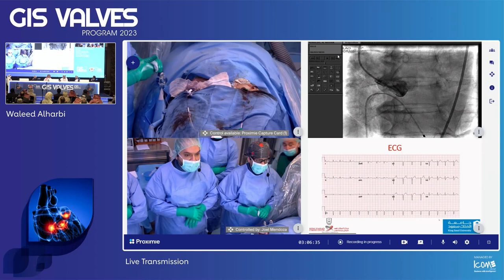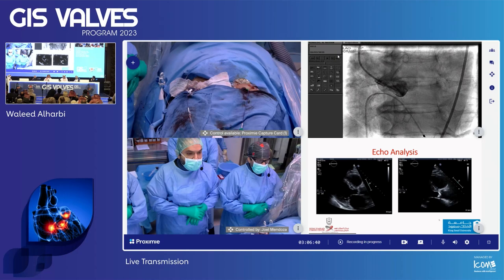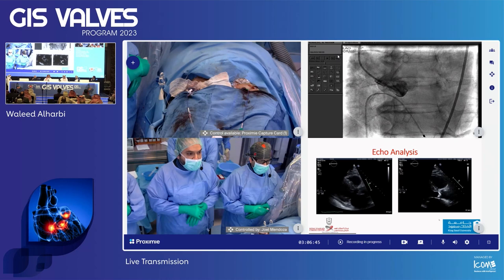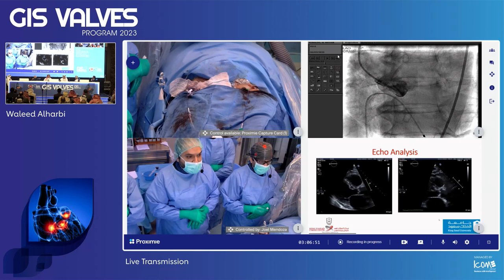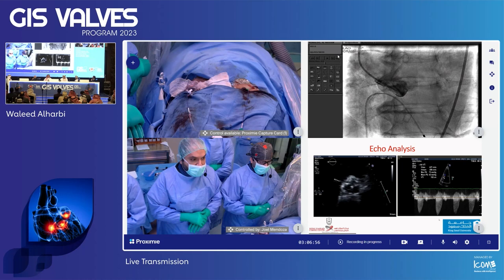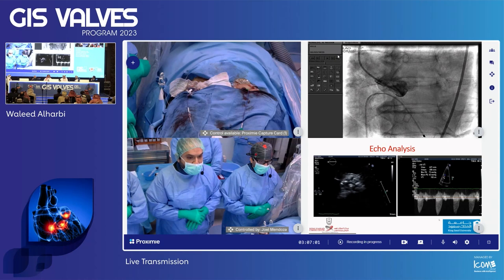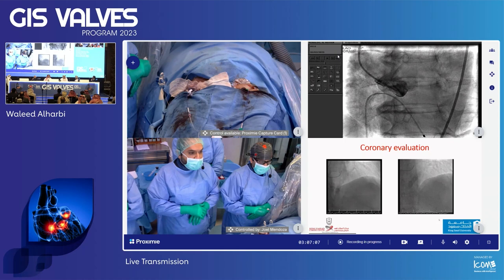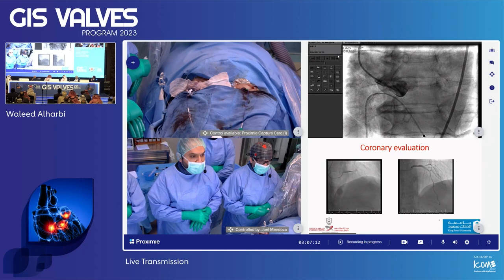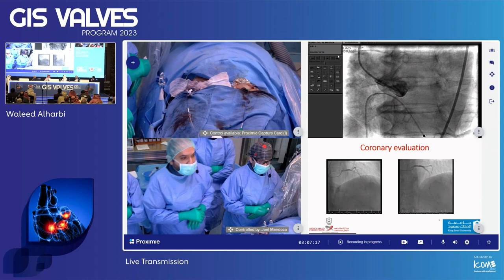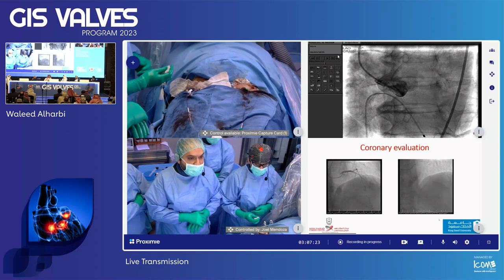This is her ECG demonstrating atrial fibrillation. Her echocardiographic images show a parasternal long axis view with a heavily calcified aortic valve, barely opening, with a gradient of 43 mmHg across it. The parasternal short axis also shows the calcified aortic valve. Her coronary angiogram revealed long-segment disease in the LAD artery on the left system.